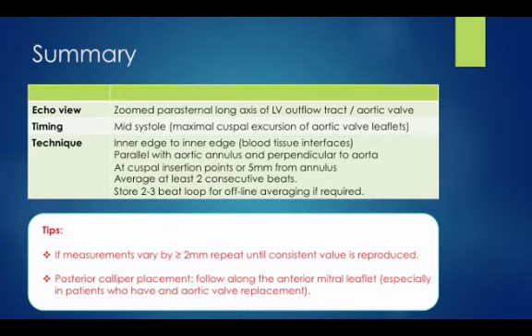Are we using the leading edge to leading edge technique or the inner edge to inner edge technique? And how many LVOT diameter measurements should we be performing? If they answered 2, I would say that is correct. But remember, we should be performing this measurement on 2 consecutive beats, not just any 2 beats. I would also reiterate some tips, such as if the measurements vary by 2 mm or more, repeat until a consistent value can be reproduced.